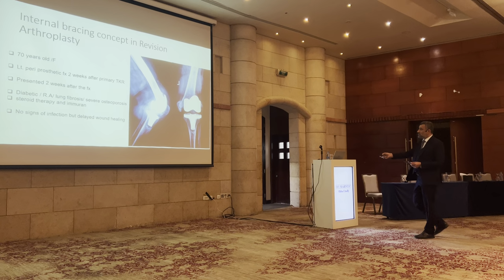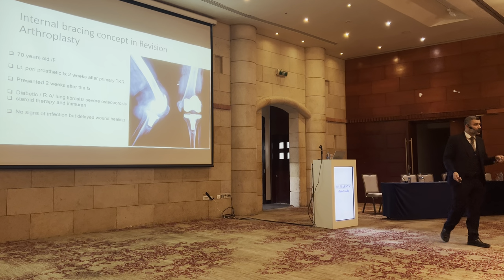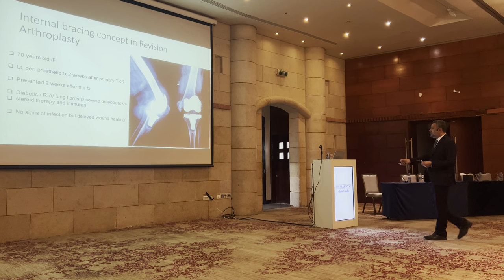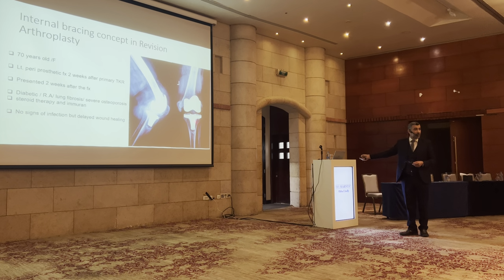And even in revision, look, this is very bad. This patient presented to me after 1 month, the wound is not healing. She has had fibrosis and steroid and so on. She fell down and has this very bad lateral condyle fracture, fracture dislocation. And you see, how can we reconstruct this very weak bone?